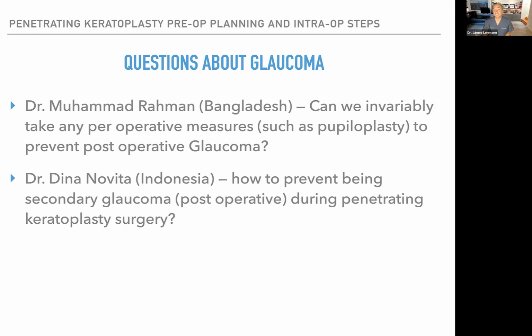But, you know, sizing the graft right, not making it too small, is helpful, because sometimes that'll stretch the angle too much. But there's a 30% incidence of glaucoma after penetrating keratoplasty. So that's going to happen kind of regardless of what we do in some situations.